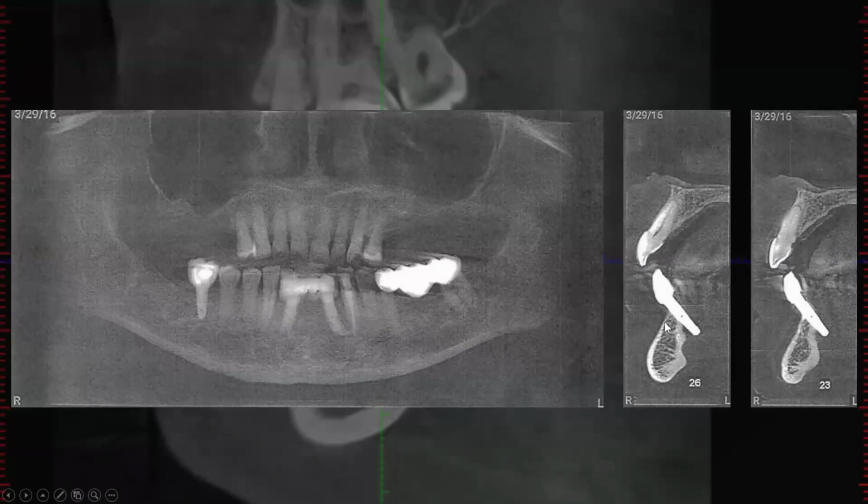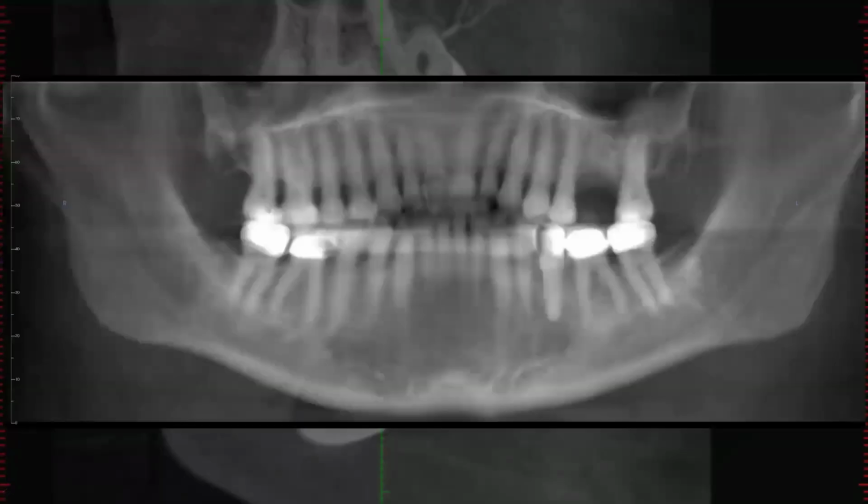But his argument was these are osteointegrated. They're solid in there, even in a little bit of bone. You know, if the body heals well, titanium really integrates into bone. And so these could be solid in there, but she's got these things kind of protruding out of the back of her, the lingual surface of the mandible. And so the surgeon saw that, and I don't know if the surgeon encouraged her to sue him, but he was under some legal litigation.